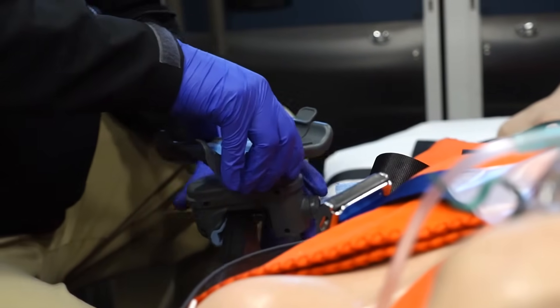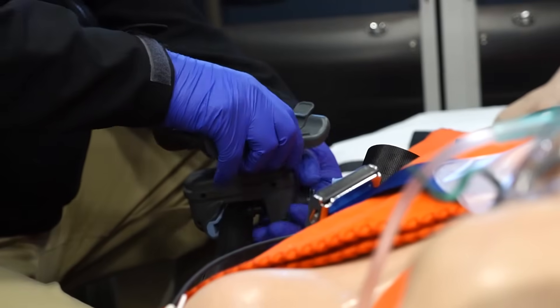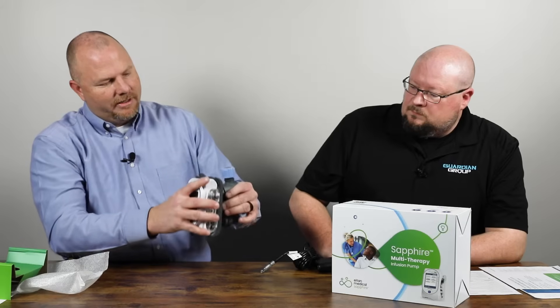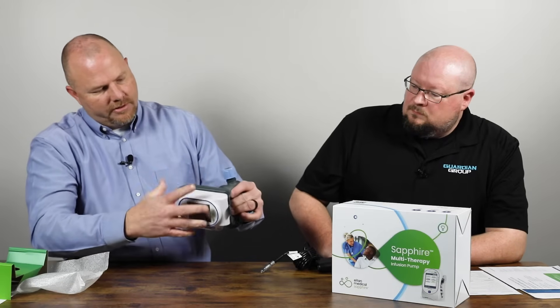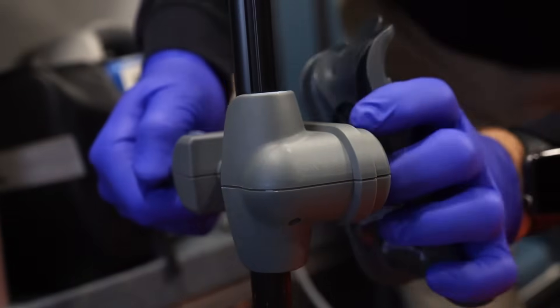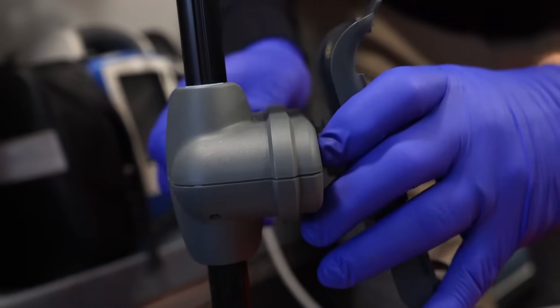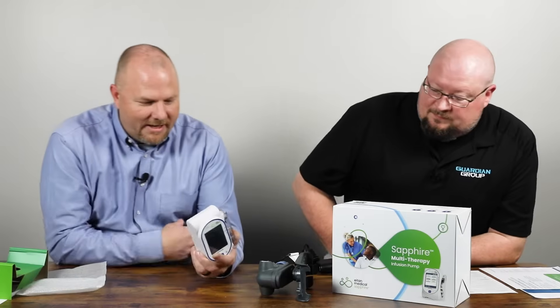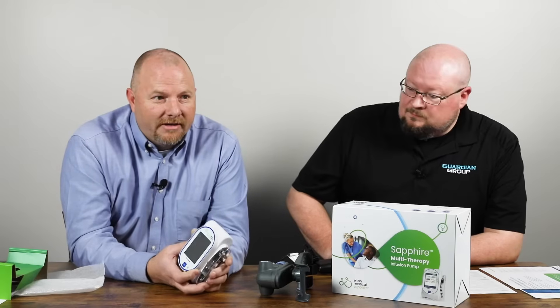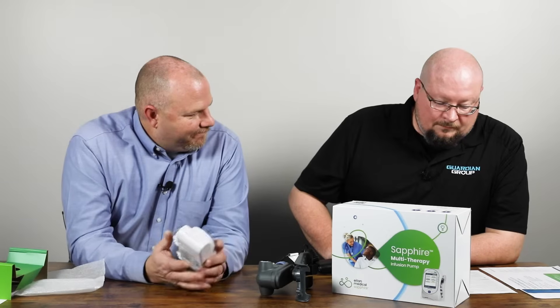This cradle is pretty simple — it's just a plastic cradle that snaps into place. It is spring loaded, so you can have different mounting options if you need to hang it on an IV pole or the arm of a stretcher, whatever the case may be. This pump is the only pump on the market, as far as a new pump, that is rated for both ground and air transport, which is a huge thing today.